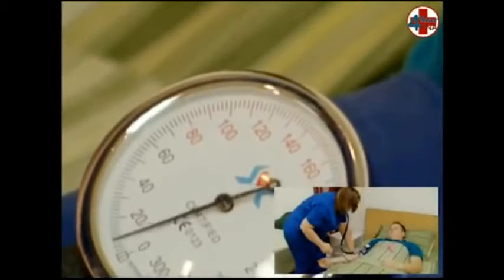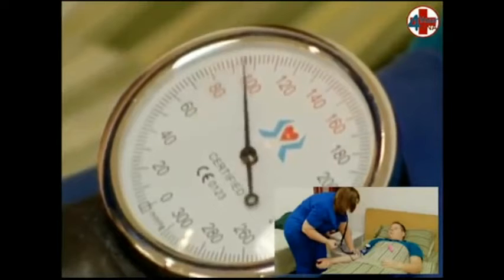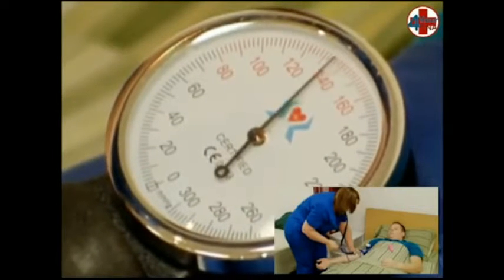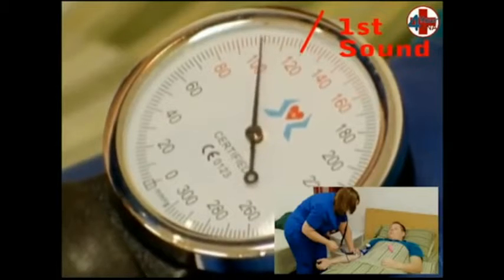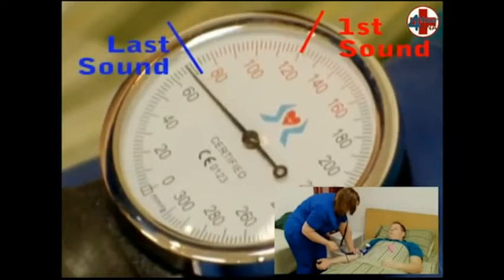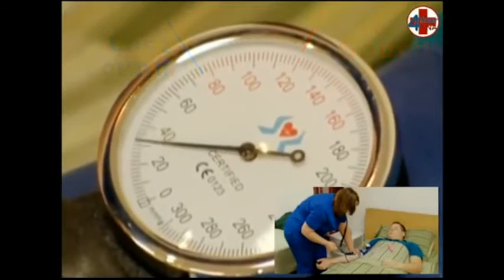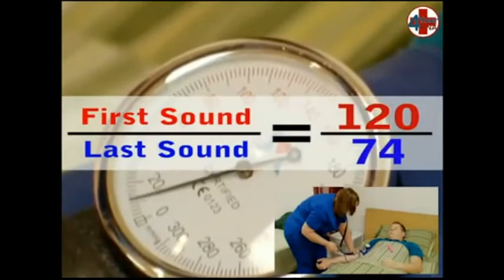Turn the valve to the right to close it and inflate it to 180. Open the valve slightly to the left to let air out so that the needle descends at a nice controlled rate. Listen for the first and last Korotkoff sounds. The needle may bounce with each heartbeat, but we record what we hear, not what we see. Keep this slow controlled rate all the way to zero. In this demonstration, the first Korotkoff sound was heard at 120 and the last at 74.